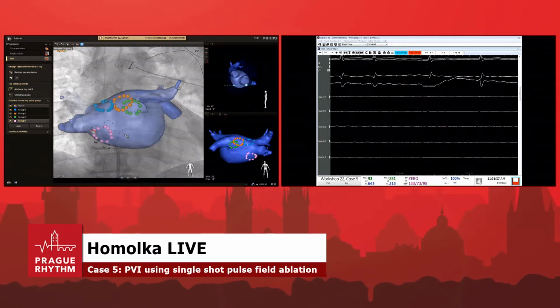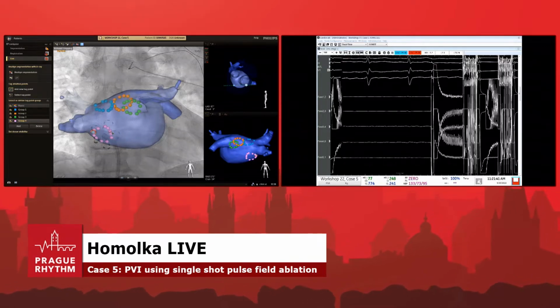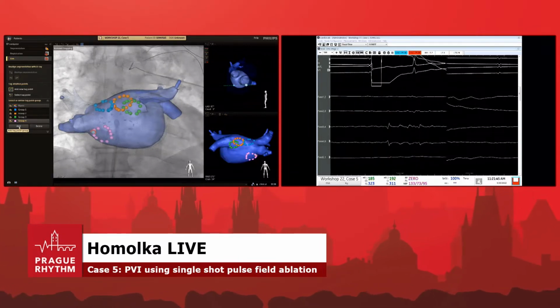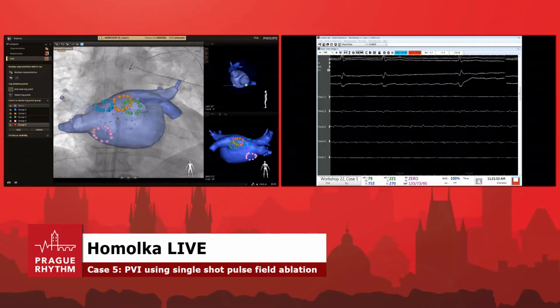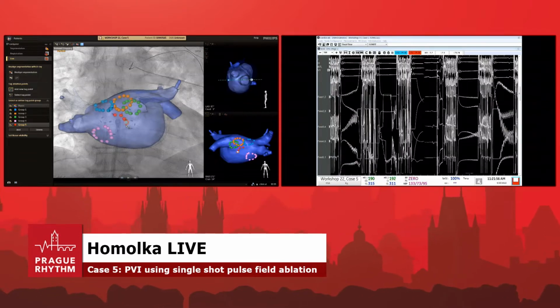One more. Fast, fast, fast. We have only 1 minute. Okay. Let's go more. Now, happy here? Okay, let's go. So we are overlapping, with guidance of fluoro, or you can do it with intracardiac echo guidance to cover.